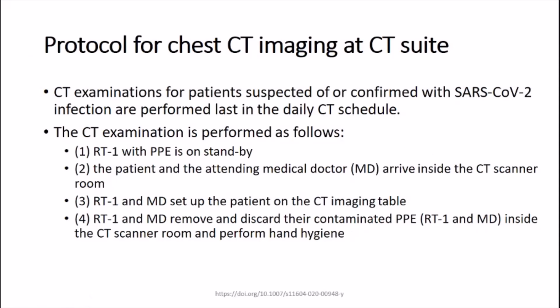The protocol for chest imaging at the CT suite. So let's say a patient came to the department, suspected of having COVID-19 or clinically proven to be COVID-19. What will happen is as follows.